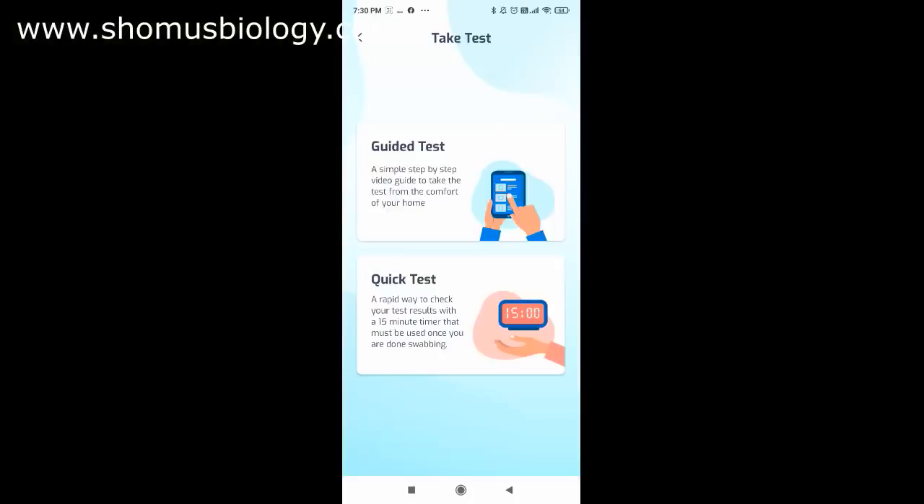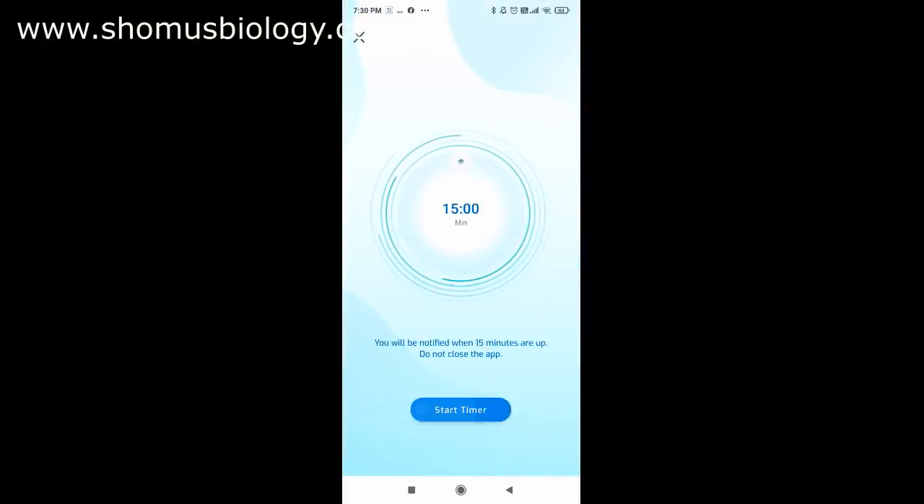I've taken the swab — everything is done. Now I'll turn on the timer in the app and click 'Start Timer.' I'm not going to hold the camera here for 15 minutes, so I'll stop the video and show you the results after the timer ends.